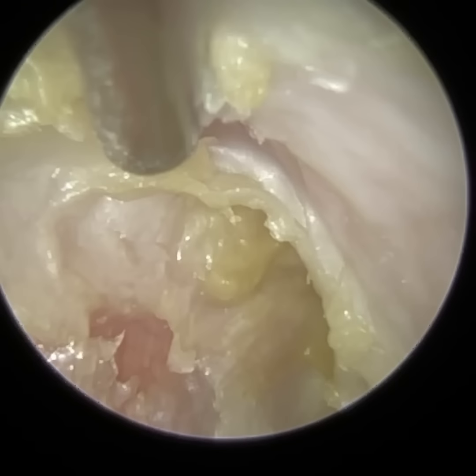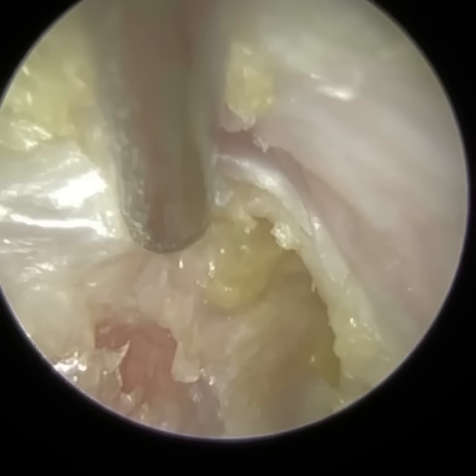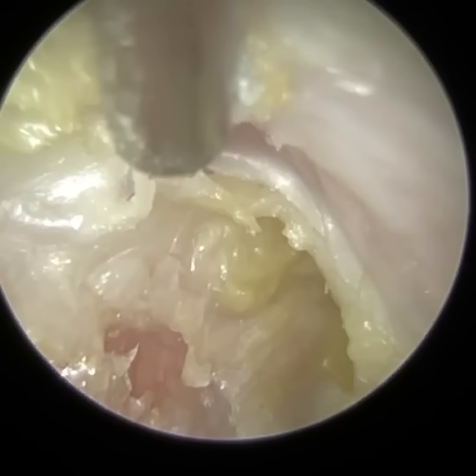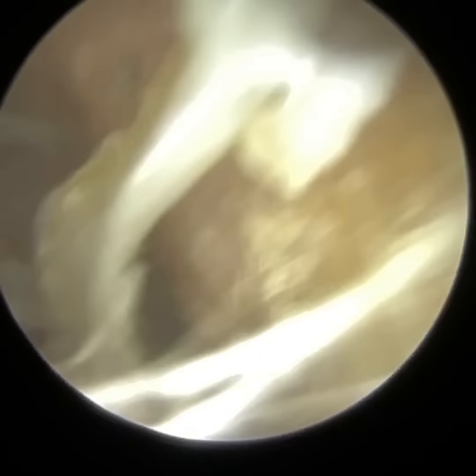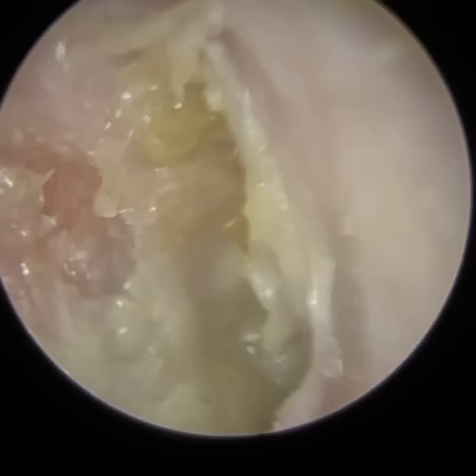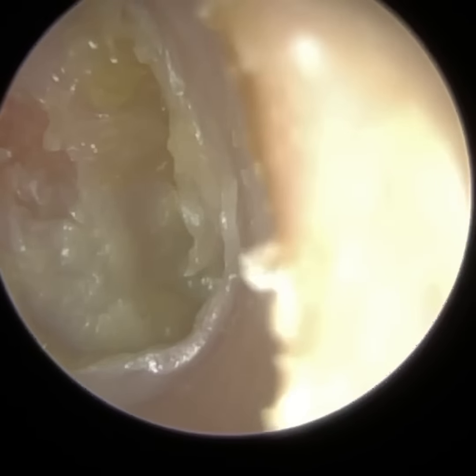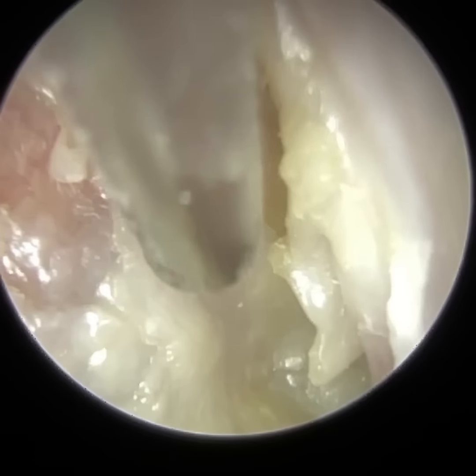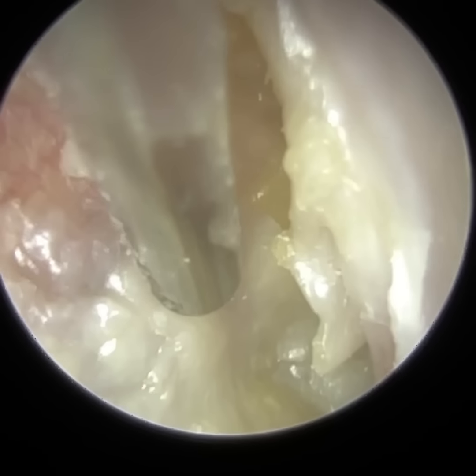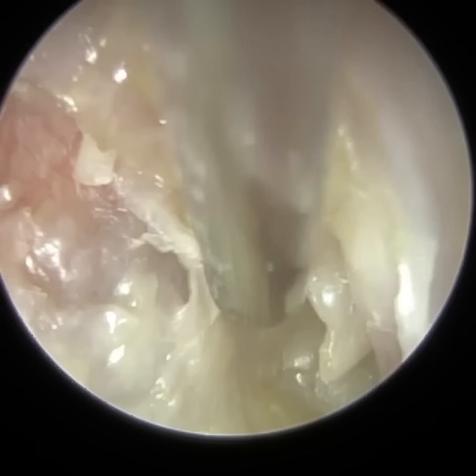So I wouldn't do this with a normal size suction tip. The normal size suction tip is a 14 gauge. I have different people telling me differently how you pronounce it. That's based on the Birmingham gauge system. There's also a French gauge system. So typically, if you use the French gauge system, it's a 6 French gauge. And to work out the outer diameter of a French gauge, you just divide the number by 3. So if it's a 6 French gauge, it's got an outer diameter of 2 millimeters.